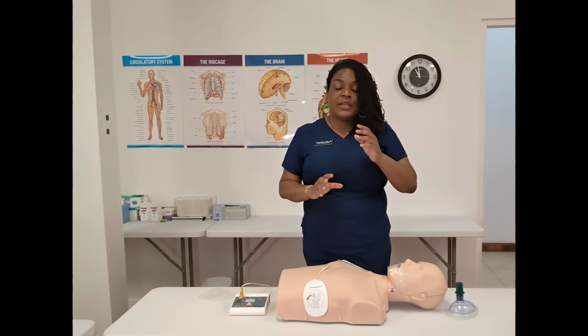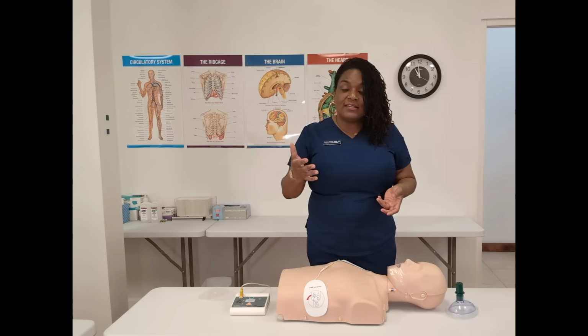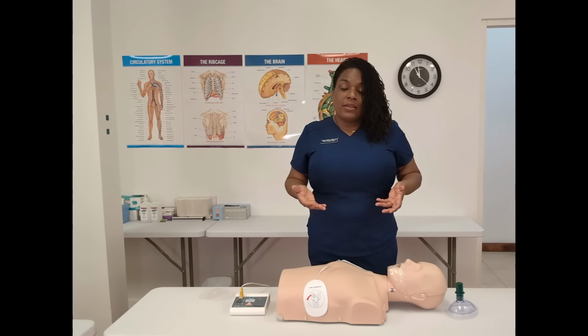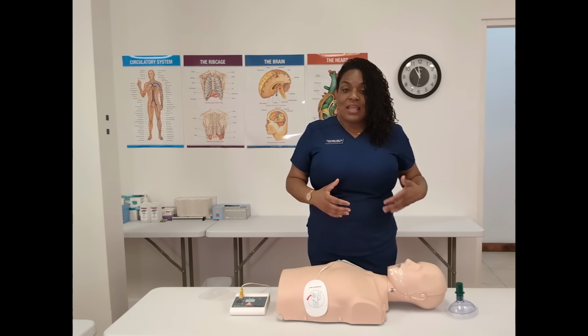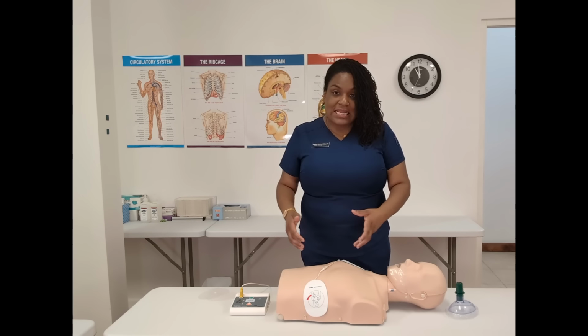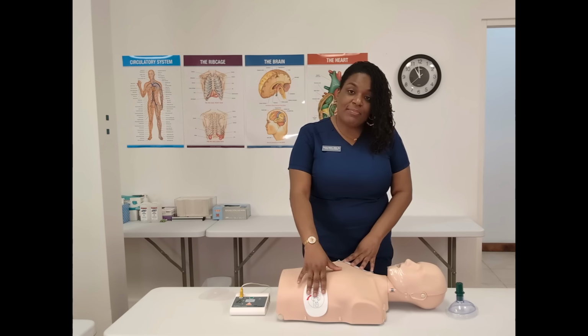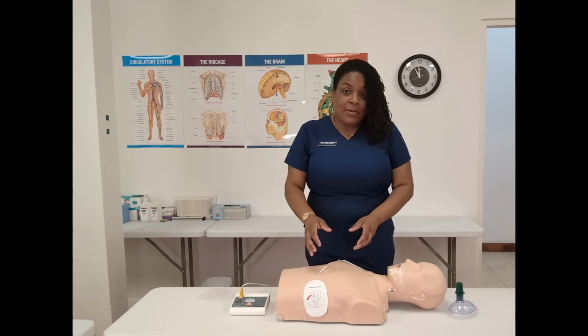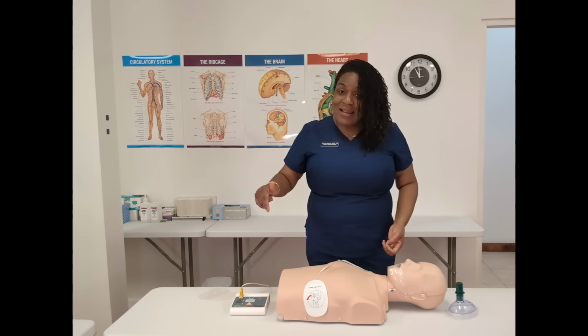In the real world, you would keep your AED on until that person reaches their final destination. So let's say that you're in the daycare center and you have to use the AED. You keep that AED on until the paramedics place theirs on. The paramedics are going to keep their AED on until the person gets to the hospital. Even if the person is talking to you, they've regained a pulse, do not take the AED pads off and don't turn the AED off, because these pads are usually single use. And if the person loses a pulse again or if they stop breathing again, another shock may be required.